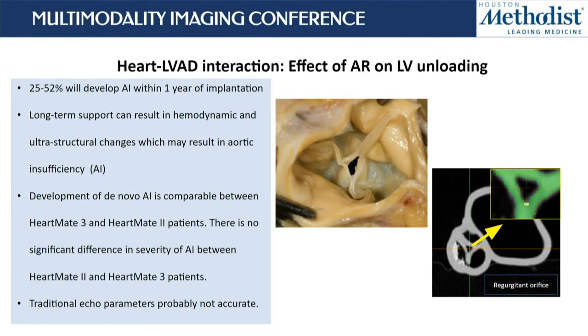unfortunately not. So the problem with echo is twofold. We don't really have a gold standard to quantify aortic regurgitation volume against. I worked with Dr. Little in the last year, and we created a mock flow loop, and that publication will be out soon, in the next couple of weeks.